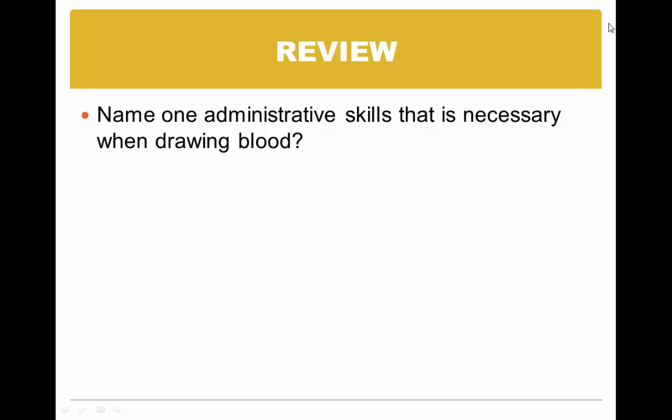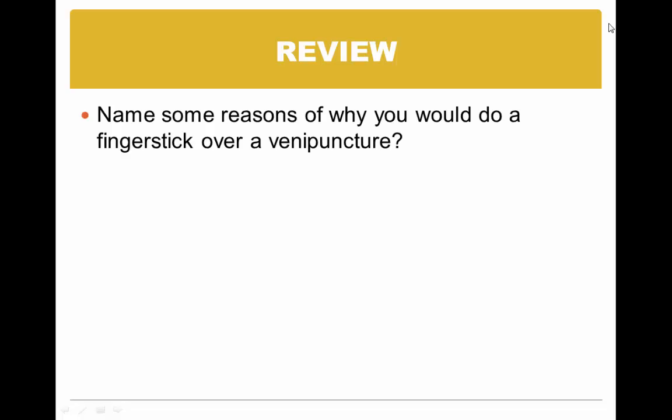Some of the reasons why you would do a finger stick over venipuncture: the amount of blood is what? Small. So if we only need a small amount of blood, we can do that. If they don't have good veins, or if the blood volume of a patient is a concern, like infants, you might do a finger stick.